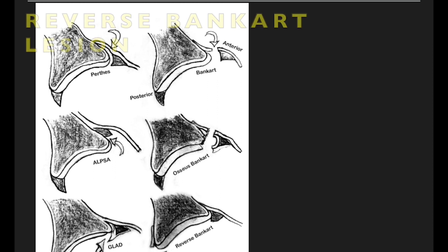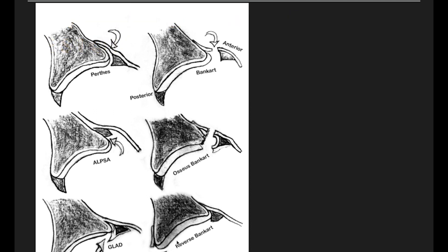This is the reverse Bankart lesion. You can see it in posterior dislocation of the shoulder. You can see the detached posterior inferior glenoid labrum along with tear of the periosteum. So it is exactly like the Bankart lesion but it is present in the posterior inferior aspect rather than the anterior inferior aspect.